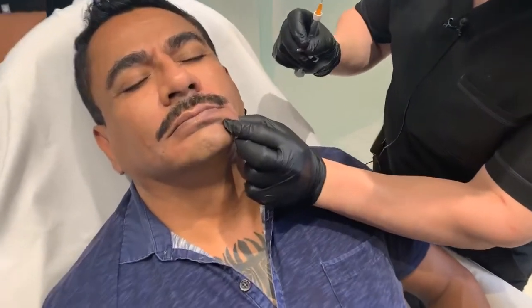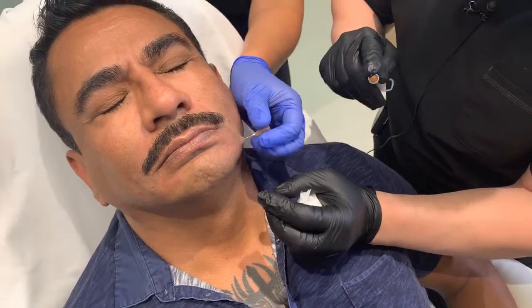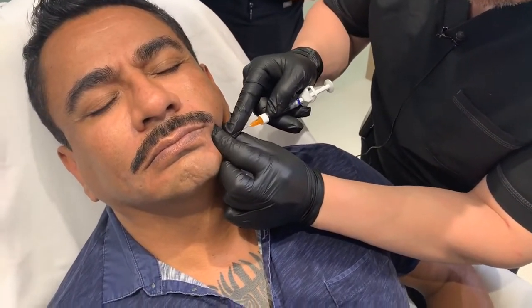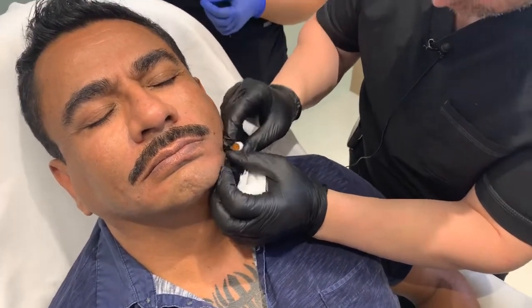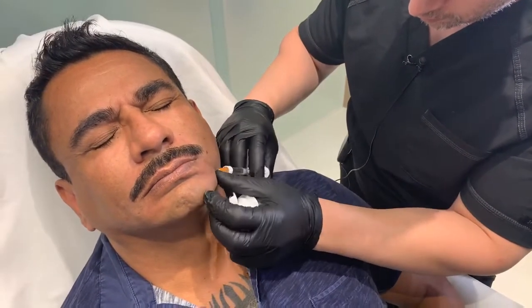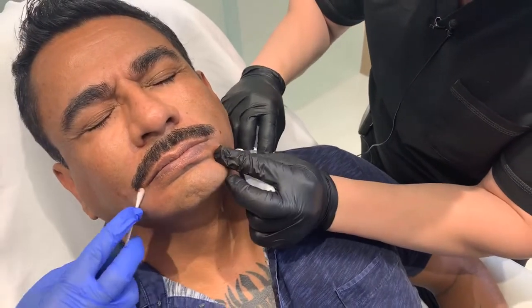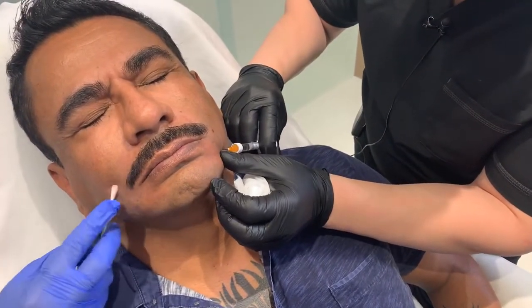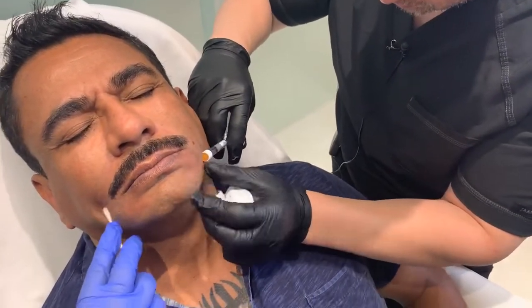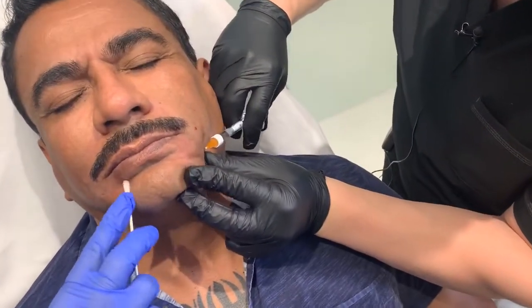So you see this little indentation here in the mouth right there. So we're going to go right there, into that spot, sorry, right here, into that corner of the mouth. And then we're going to work our way over into the marionette area, right here on the chin. Okay, giving him some volume.